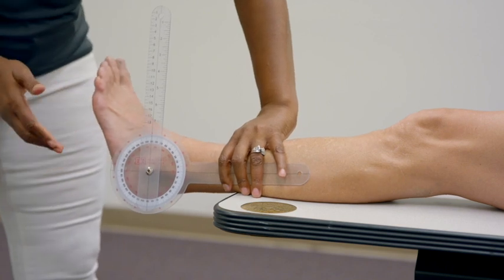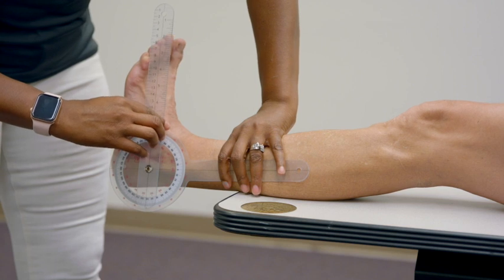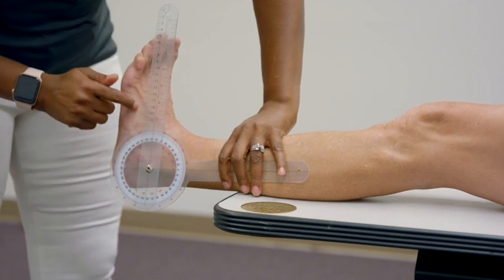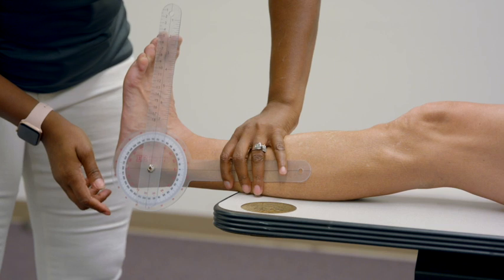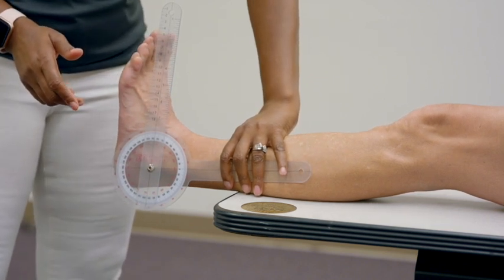Have your patient dorsiflex, and make sure this line is very parallel to the fifth metatarsal. Have them keep pushing as far as they can. In this instance, Suze has about five degrees of dorsiflexion range of motion.